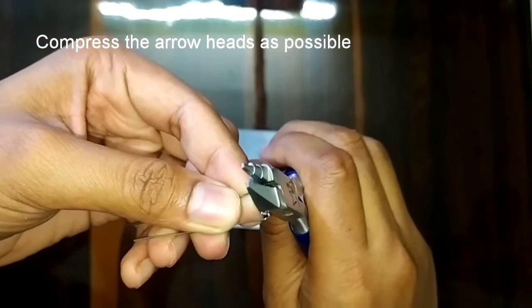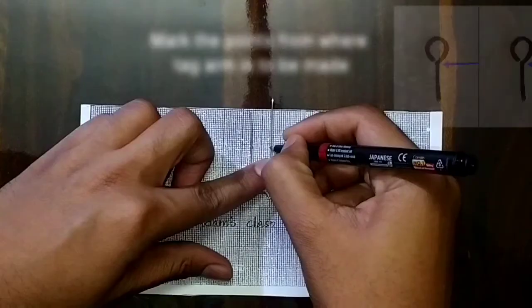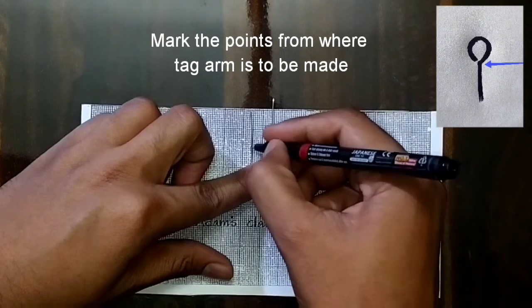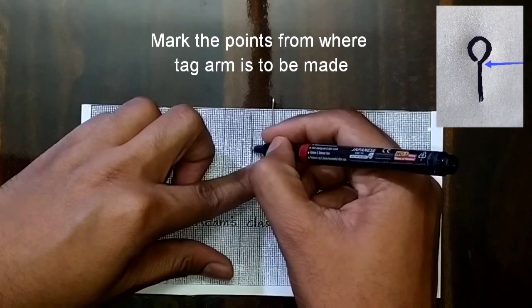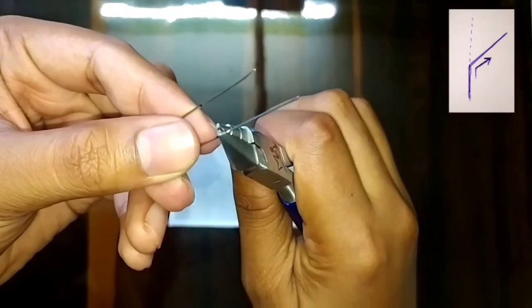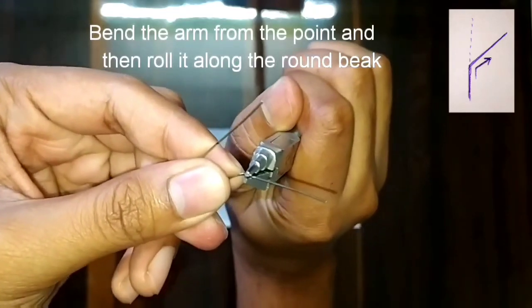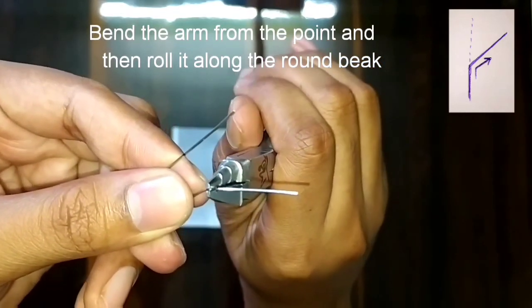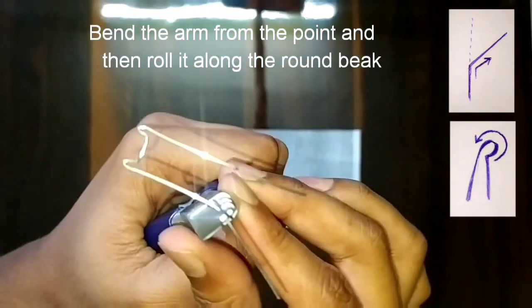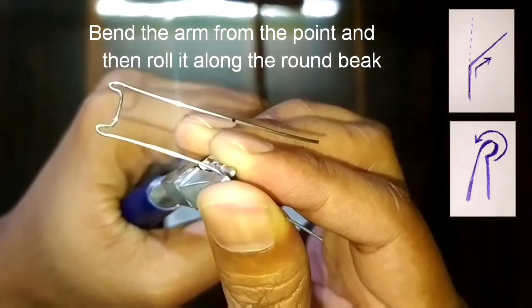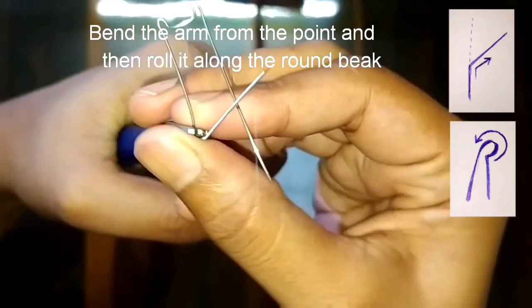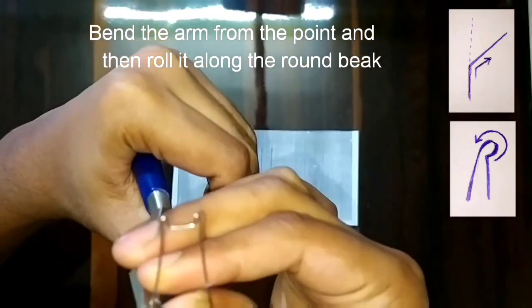Try to make it a bit sharp. We will mark the points on the retentive arm from where the tag arm is to be made. For making the tag arm, we will first bend the wire from the point towards outside as shown in the figure, then roll the wire along the round beak as shown. Do it from the tip so that the smallest curvature could be given to the tag.